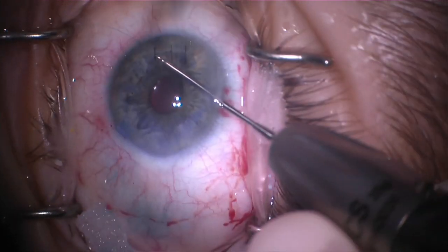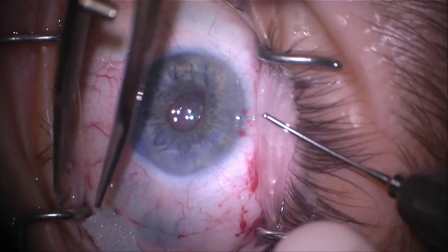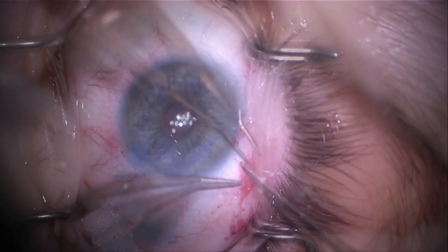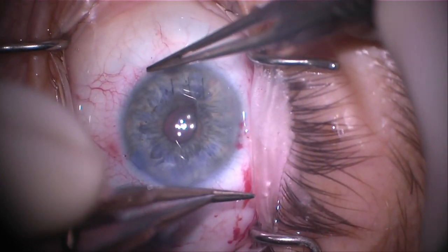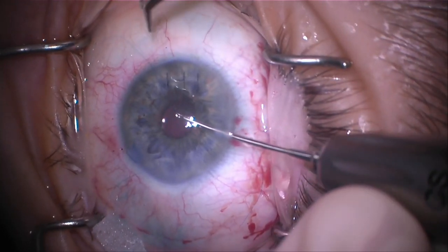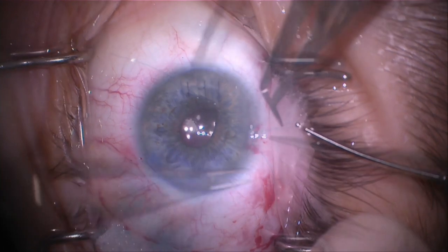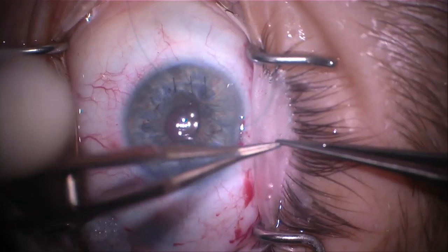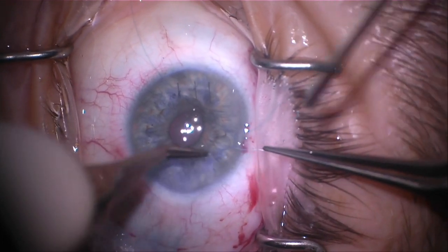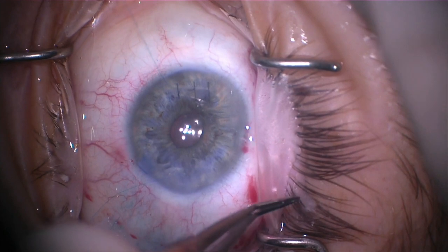We'll go back with our condon snare and grab that distal loop of suture between the iris defect and the exit wound. Line up our sutures — one, two, three. This time we're going to do a single throw in the opposite direction: pull the loops through, pull both free ends, and it's going to pull that throw into the eye. Be careful here because you have the knot started — make sure you don't mistakenly pull the knot out of the iris. Throw number three: going the original direction, the same as the first portion of the knot. Pull the loop through, grab both free ends, pull the knot into the eye, and now we've completed our 2-1-1 knot.